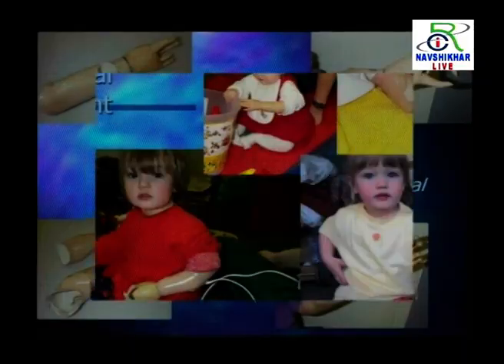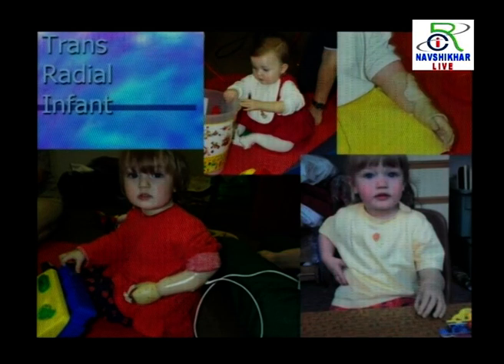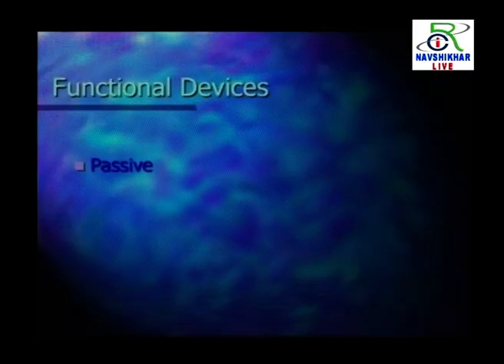But the battery packs can be individually interchanged. The wrist unit can be interchanged. And if the wrist unit is interchanged, a hand unit can also be interchanged, from a gripper to a hand unit, and such type of transradial infant hand. Then there are functional devices.